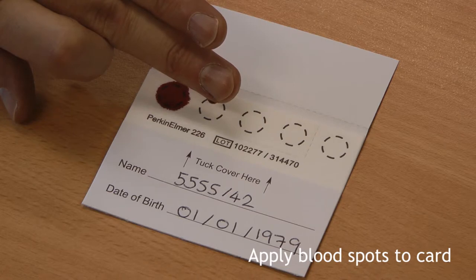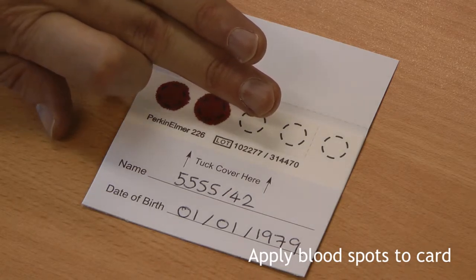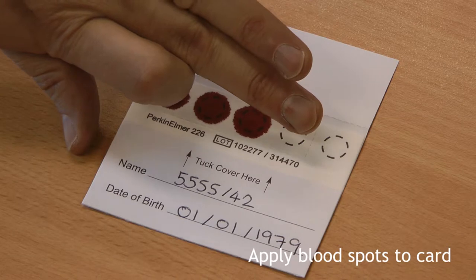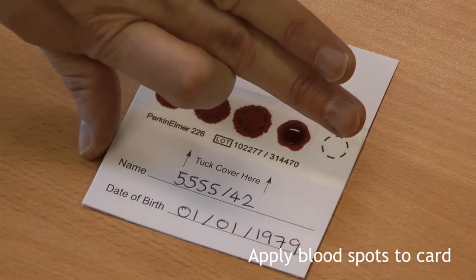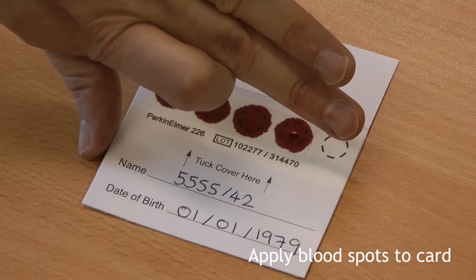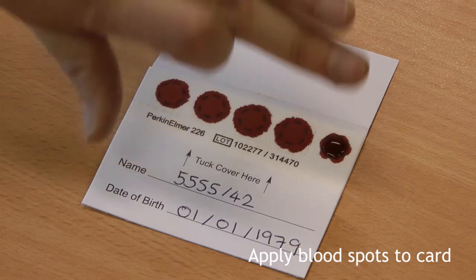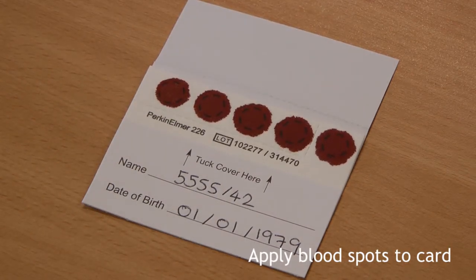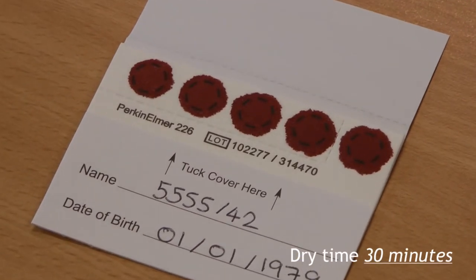Ask the patient to hold the bleeding finger over each circle on the card, and if necessary, press the finger to encourage bleeding. Spot blood onto each of the five circles on the card as shown, making sure enough blood gets onto the card to fill each circle. Don't fold the card closed just yet. Leave it for 30 minutes to dry.